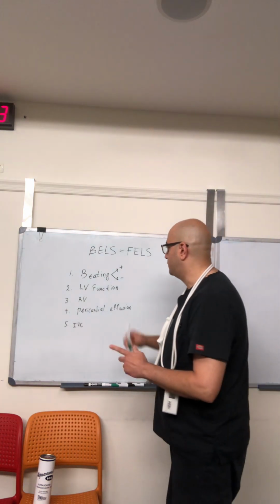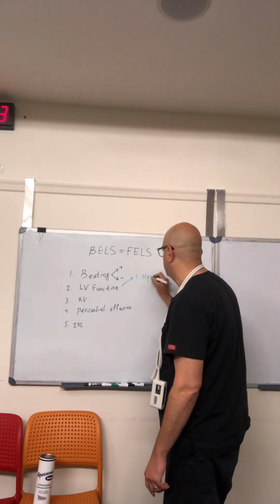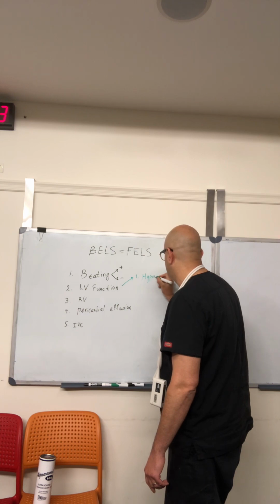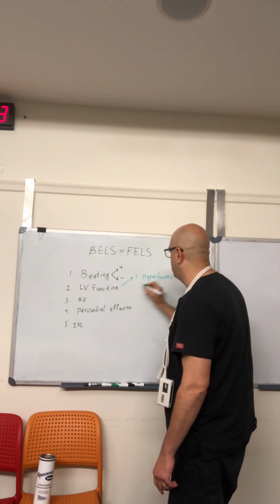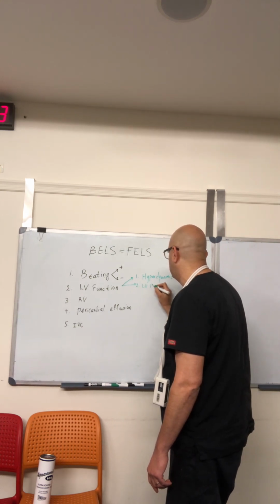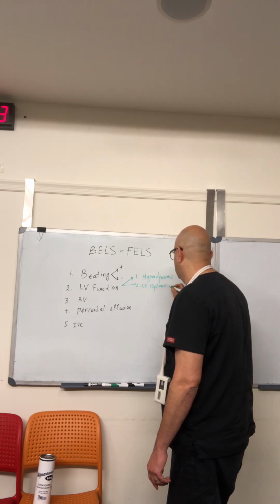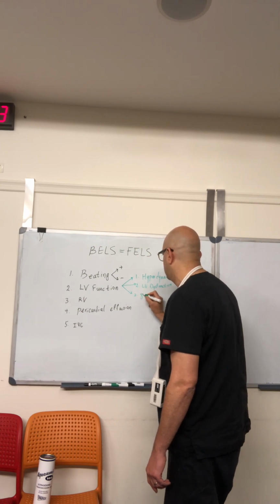So for LV function, you need to answer one of: hyperdynamic, LV dysfunction, or grossly normal.